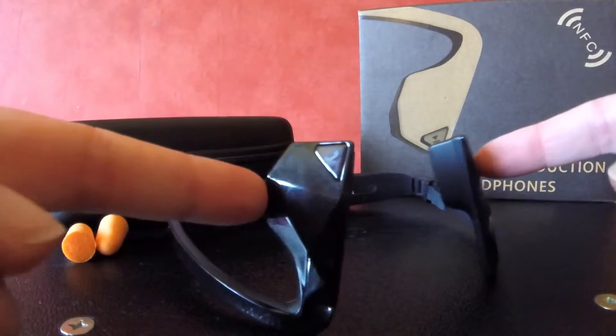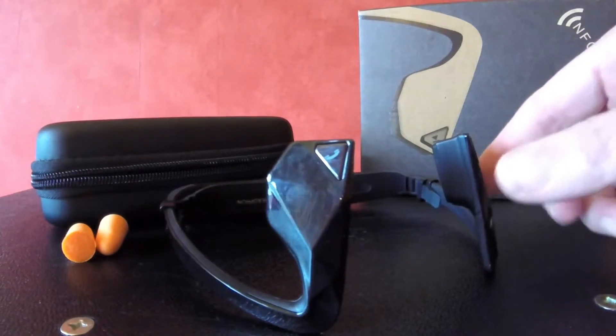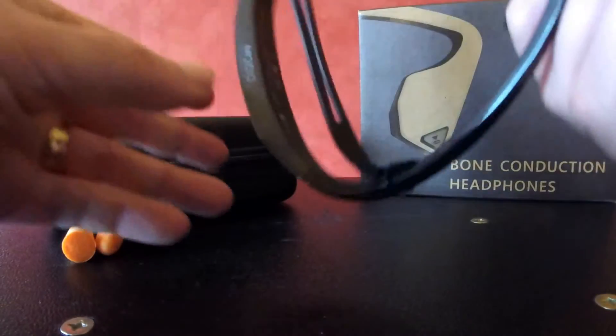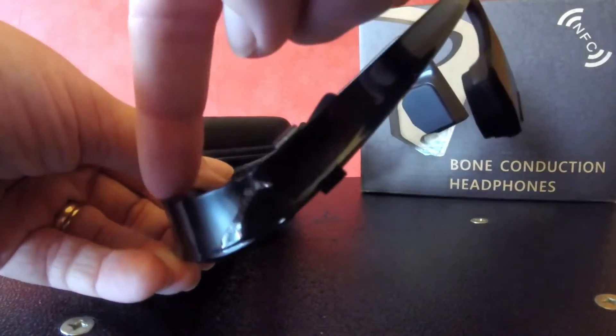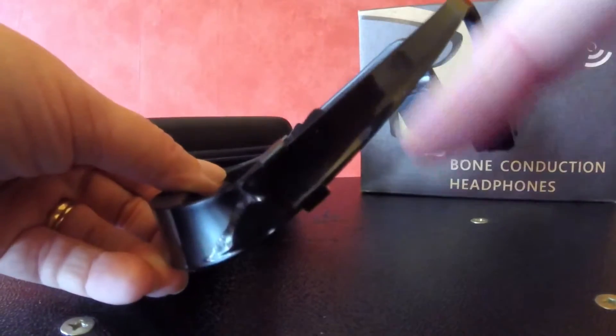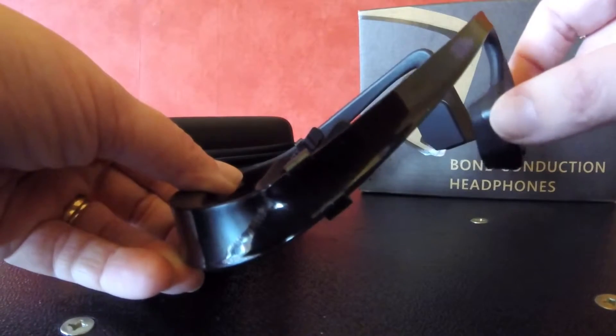These things don't go in your ears, they go in front of your ears. If you can imagine, that bit goes at the back of your head. That's where your ear goes and that sits in front on the bone.